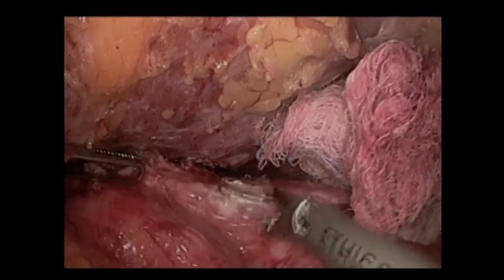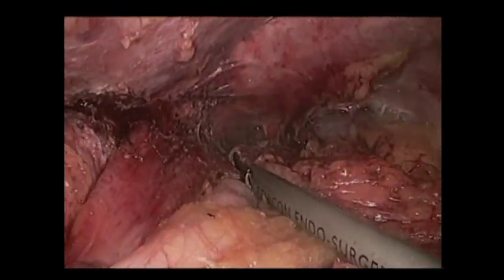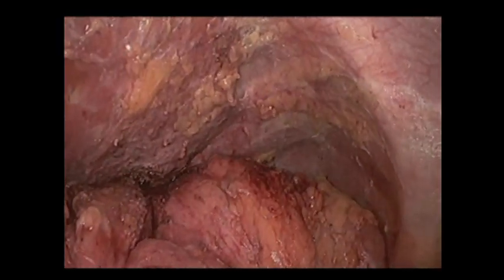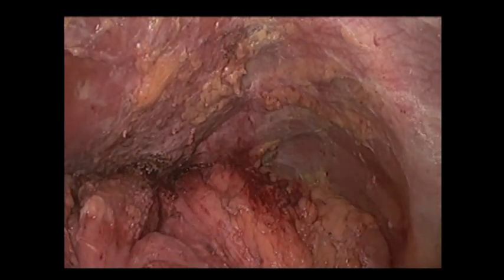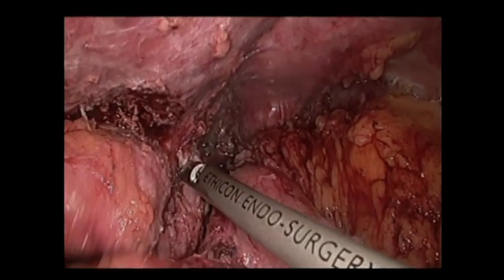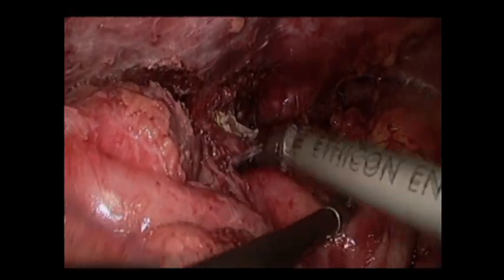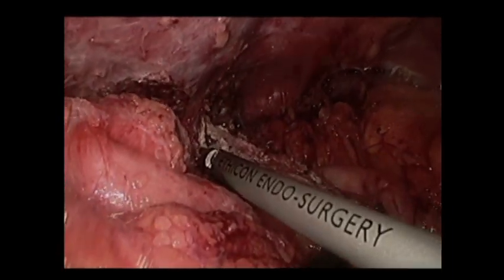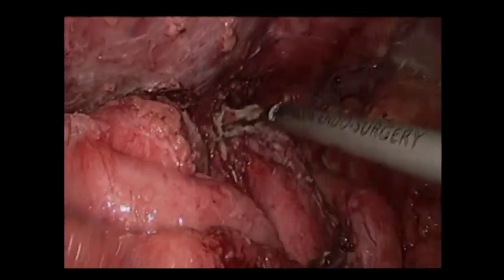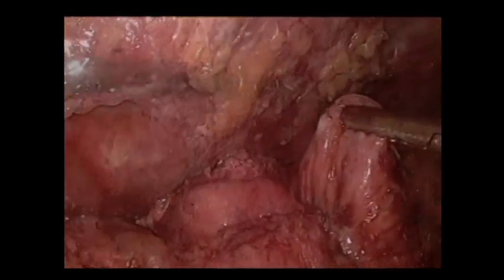We then proceeded to separate the gastric remnant from the gastric pouch and the Roux limb, and we performed upper endoscopy. You can see the scope would easily pass into the remnant through the fistula, but we could not pass the scope into the Roux limb. So we then made a gastrotomy in the gastric remnant to localize the fistula track, and here you can see the fistula track near the gastroesophageal junction.